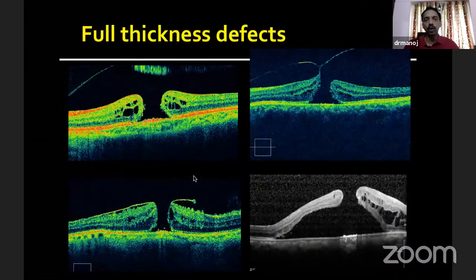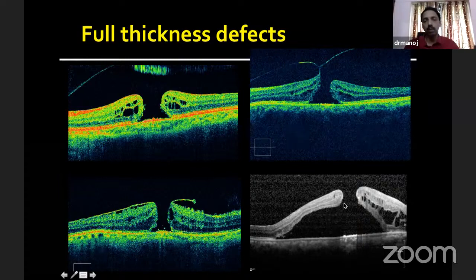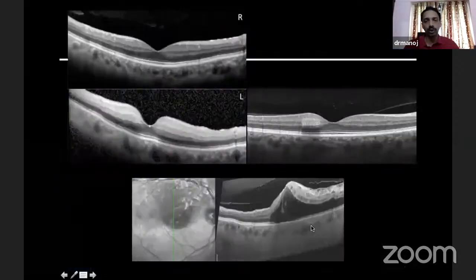Finally, you have full thickness defects, where you can also see the associated pathology. Here, you can see there is a vitreomacular traction causing the full thickness defect. Here, there is a full thickness defect with an epiretinal membrane. In this situation, you can also see subretinal fluid along the macular hole. All of this can be made out on the OCT.